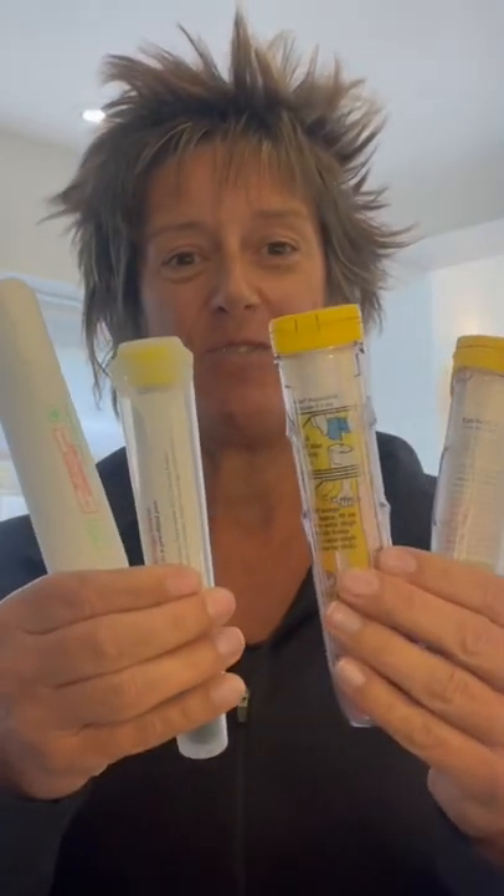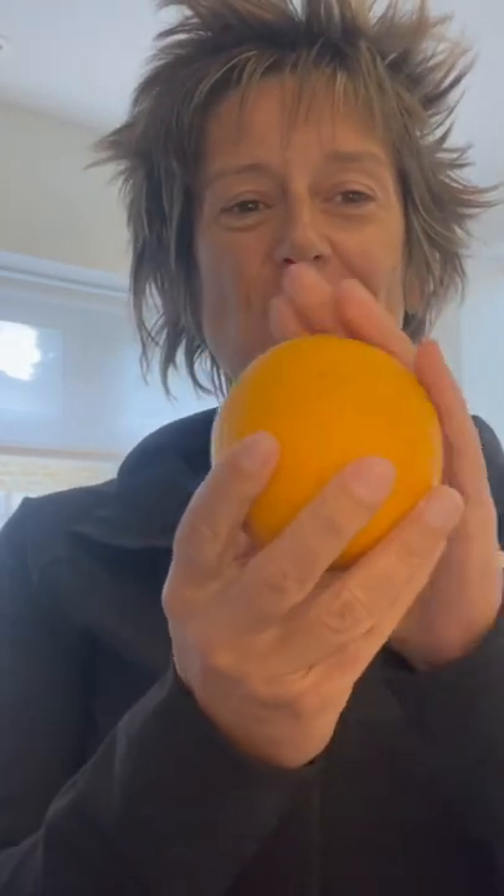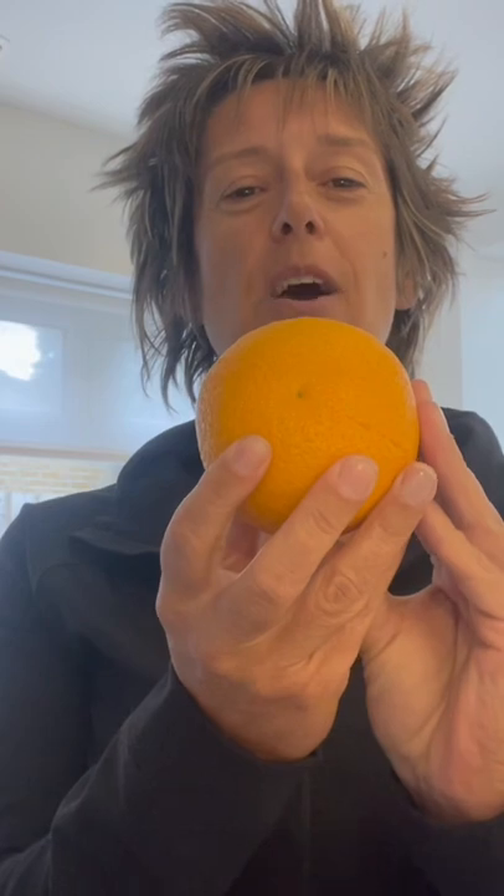I'm going to put to test all of these auto-injected pens. I have four of them here, and we're going to demonstrate them using an orange, because an orange is very similar to our muscles and our skin. So here we go.